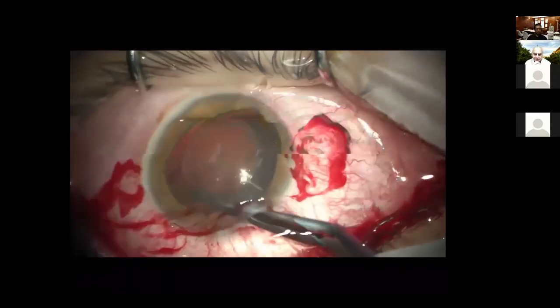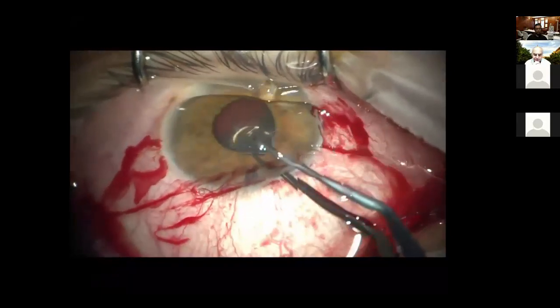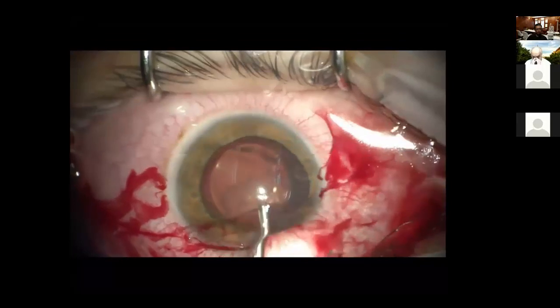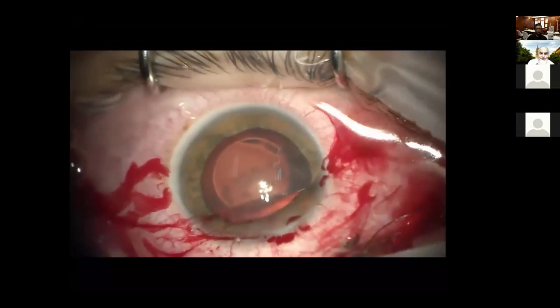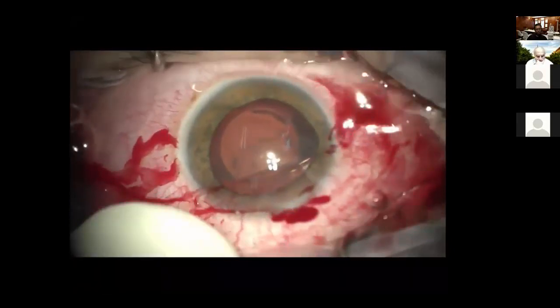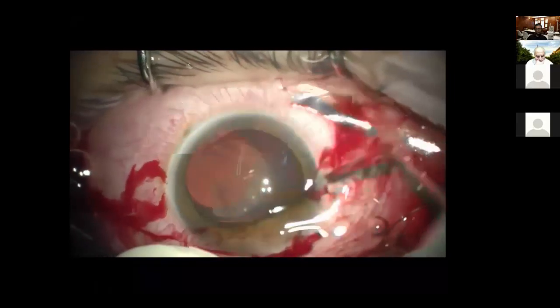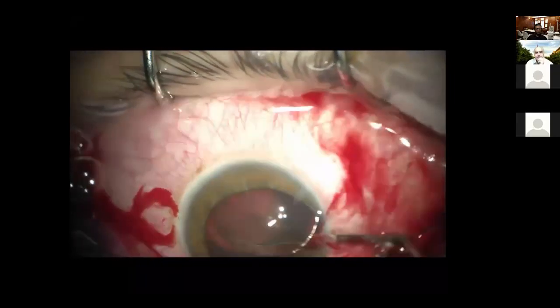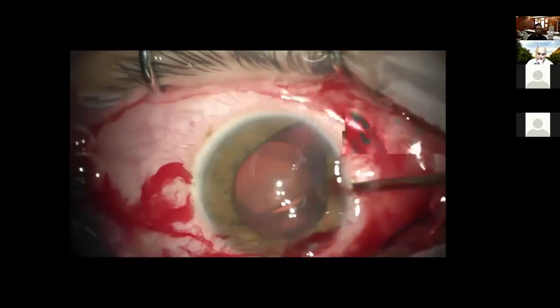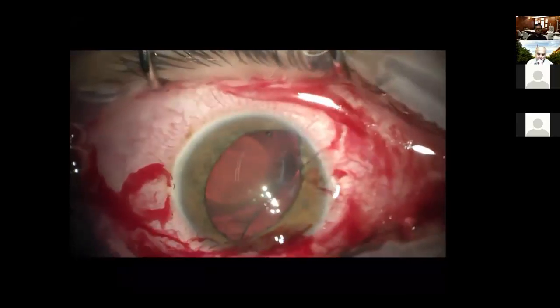This is an IPCL. Because the lens is so thin, you can pull out this lens as a whole through a regular phaco incision, but you have to deliver the lens into the anterior chamber by some manual manipulations. I used an iris repositor to manipulate my lens and deliver at least the haptic and optic part into the anterior chamber, and this allowed me to grasp this lens and pull it out through the same incision without hindering the integrity of my incision or increasing its length.